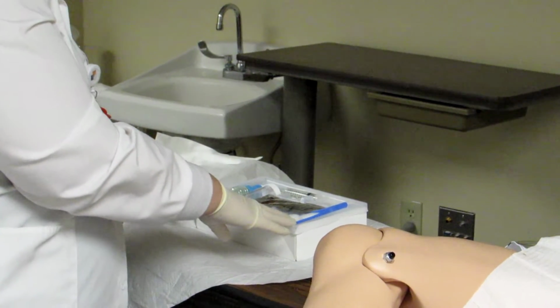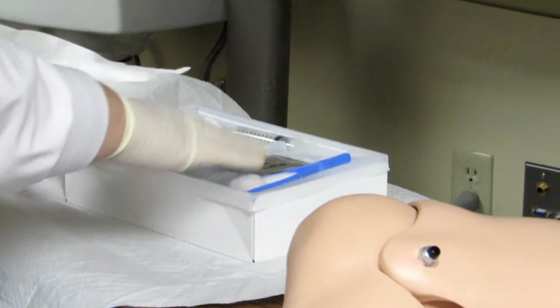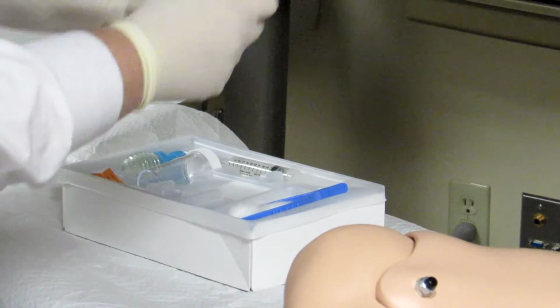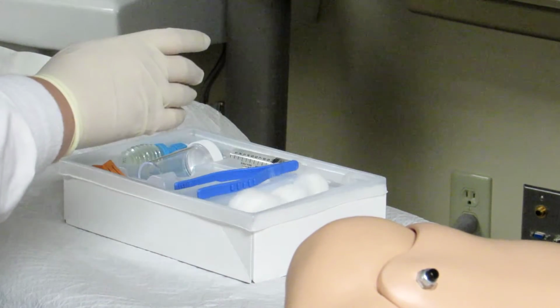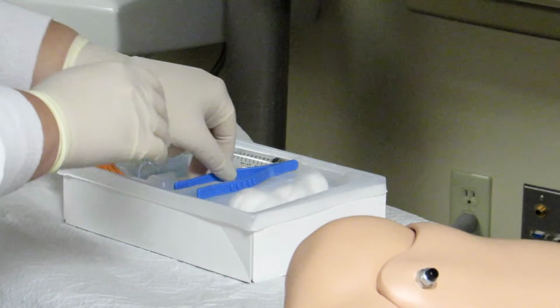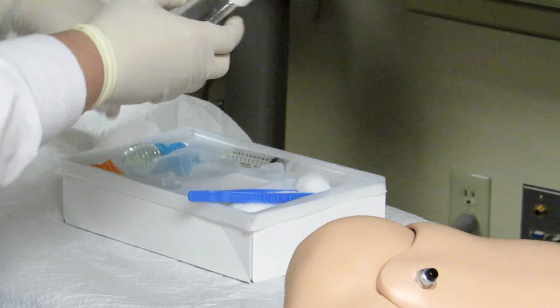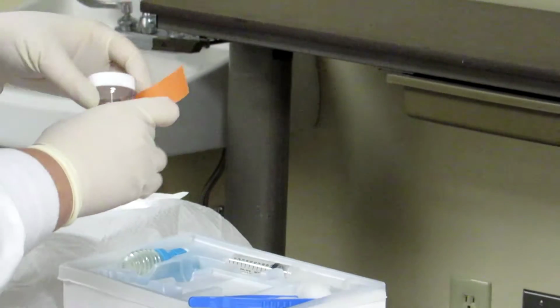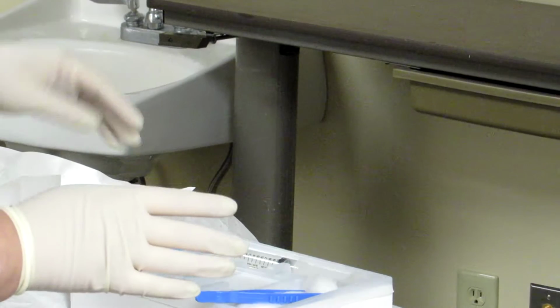Here I'm going to get my Foley kit set up. I already showed you this in video 1, but we'll see it again here. Got my iodine solution here. I'm going to open it. I'm going to put it all over my cotton balls, and I'm going to get rid of the package. I got my specimen cup and my label, so I'm just going to set that aside. I'm going to show you how to get a specimen in the third video.